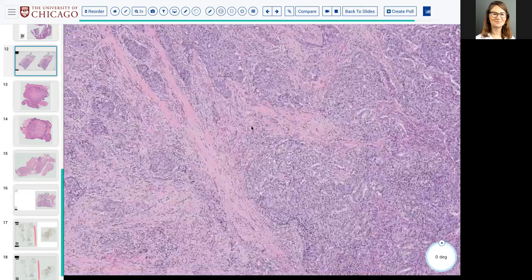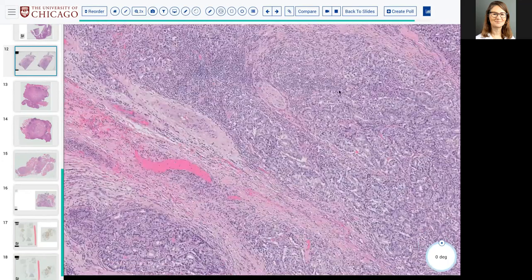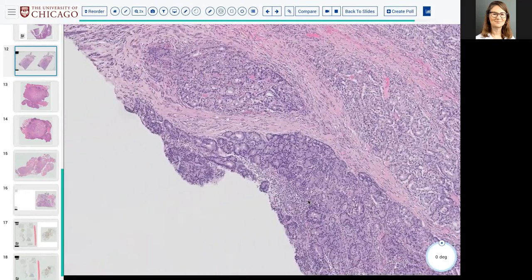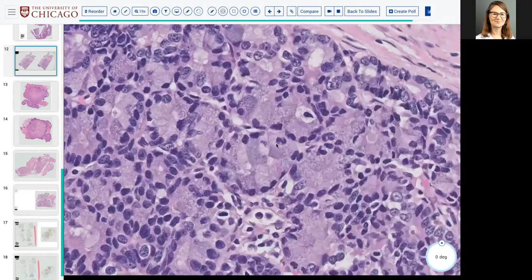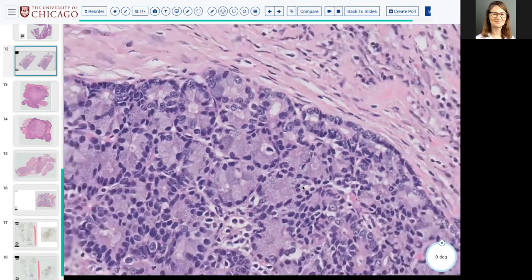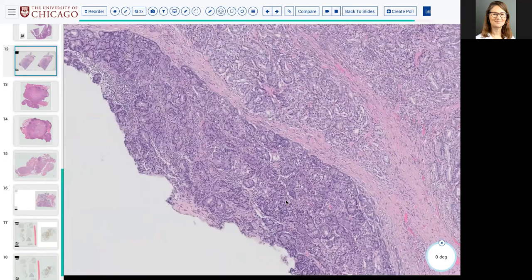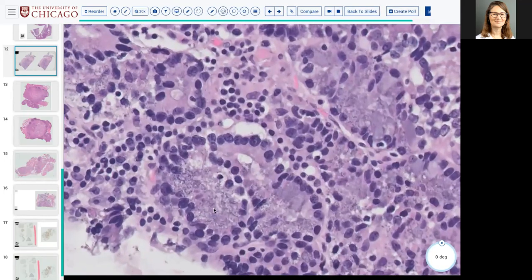Two, you may or may not see a low-grade component on histology. Three, they're generally going to do molecular testing, so you may identify a diagnostic mutation in the end. But always look around for a lower grade component to see if you can identify the origins.